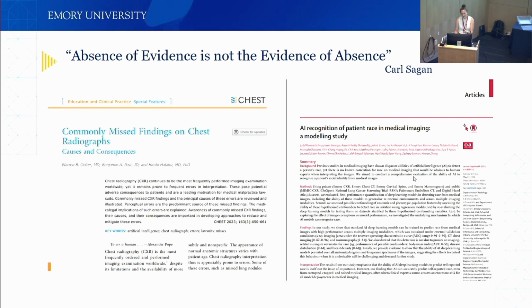And another thing is, and this is Dr. Gichoya's study, there are things that we visually don't see on X-rays, but there is data of. So they predicted race from X-rays. I don't know, I can give it a shot. I'm pretty sure I'll be really bad at predicting race from X-rays, but AI apparently isn't. So just because we cannot see things doesn't mean it's not there.